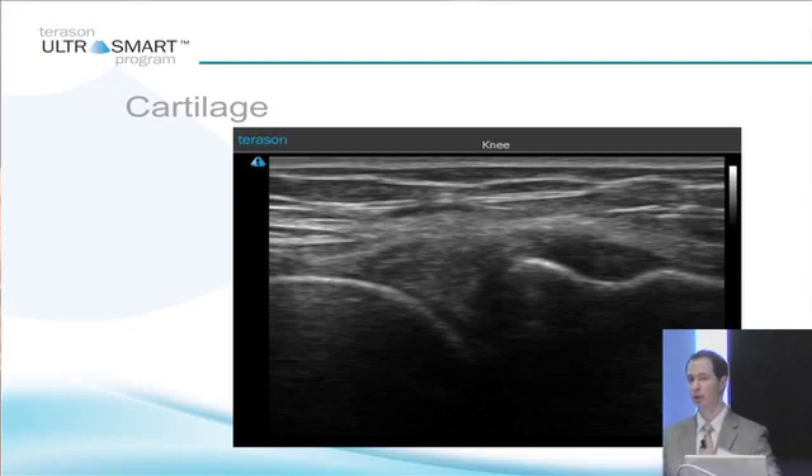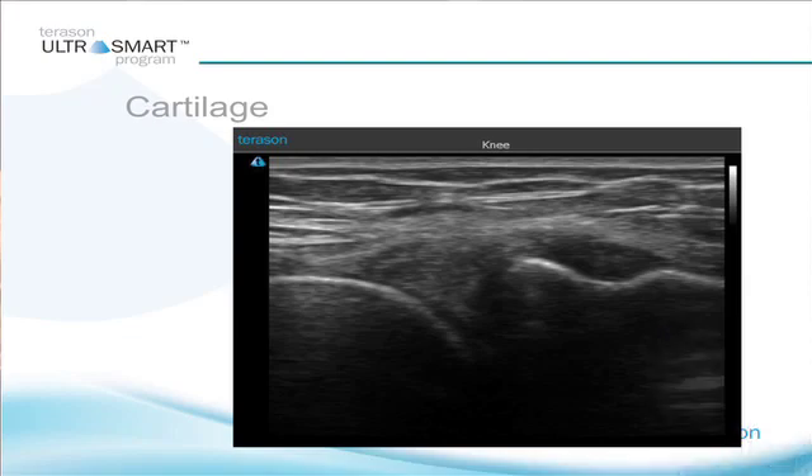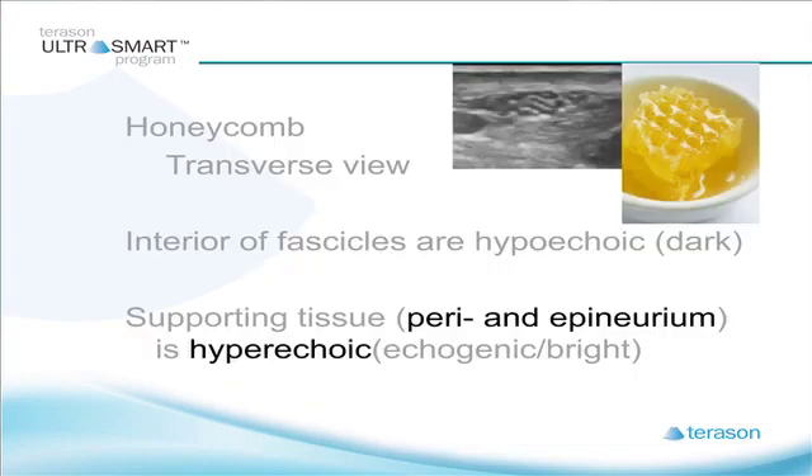Cartilage — well, it depends what you're looking at. What kind of cartilage are we dealing with here? If you're looking at hyaline cartilage, which is on the surface of the femur — this arc on the left side of the screen — that's going to appear hypoechoic, dark, because it's full of fluid. Compared to the meniscus, this triangular structure sitting right next to it, which is made of fibrocartilage and going to appear brighter than hyaline cartilage. Fibrocartilage is more dense, has less fluid, so it appears brighter; hyaline cartilage is darker because it has the fluid.